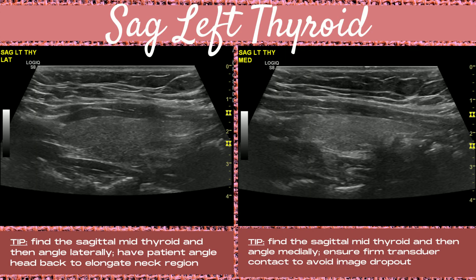Next, image the sagittal left thyroid lateral and medial sections. Find the sagittal mid-thyroid and then angle laterally, having the patient angle their head back to elongate the neck region — this ensures good transducer contact and avoids image dropout along the sides. Then find the sagittal mid-thyroid again, angle medially, and ensure firm transducer contact to avoid image dropout on the sides of the image.